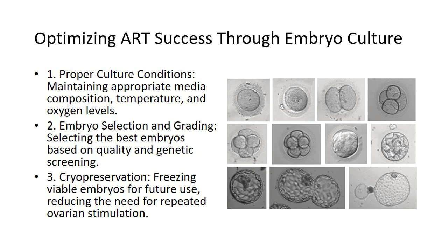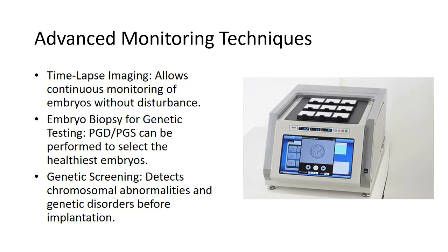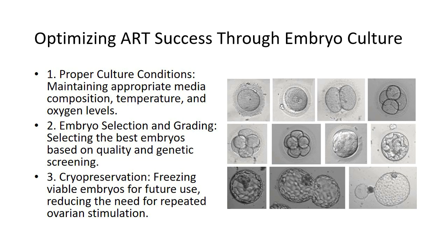Embryo surveillance. Embryos are monitored regularly during the culture period to assess their development and select the most viable embryos for transfer. Advanced imaging techniques such as time-lapse microscopy allow for continuous observation of embryo growth without disturbing the culture environment. Three, optimizing ART success through embryo culture and laboratory conditions. To optimize ART success, a few factors are critical.